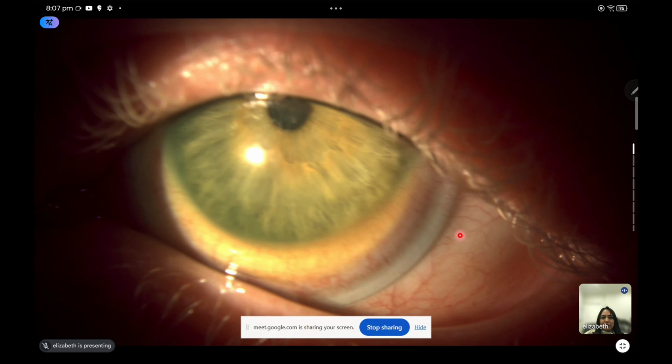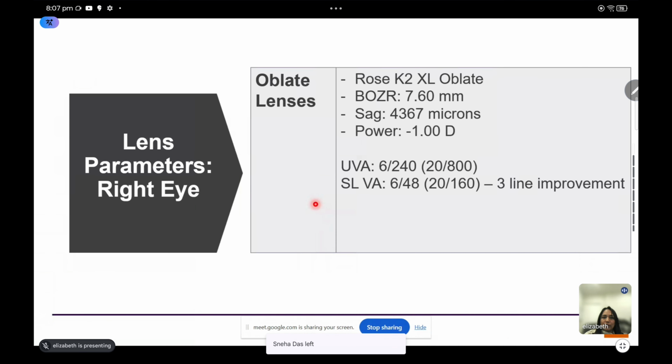So I thought to myself, okay, we've got 700 microns of central clearance. That's far too much. At the bottom where his cone is, we're getting 200 microns, which is what we're looking for. So how can I decrease this 700 microns of central clearance, make that part of the lens come closer to the eye but still maintain full clearance over the cone, which is lying here at the bottom? And that's what I thought an oblate is.